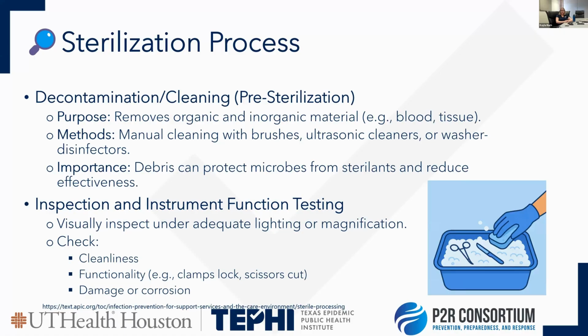During this, make sure you're auditing and looking at the brushes that sterile processing is using. Sometimes little brush fibers can break off and get lodged in things, such as different canals, and then come out during surgeries. They can poke staff members. So make sure you're inspecting your brushes to make sure they're good and not shedding, with no breaking or cracking of anything like that.